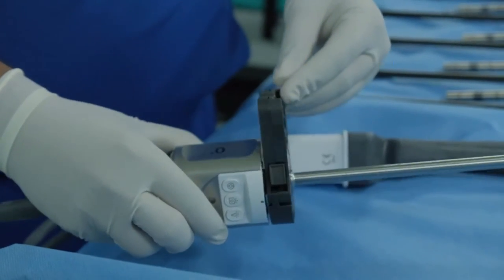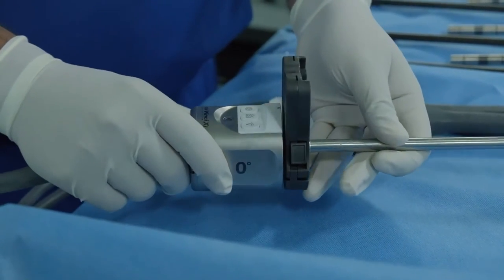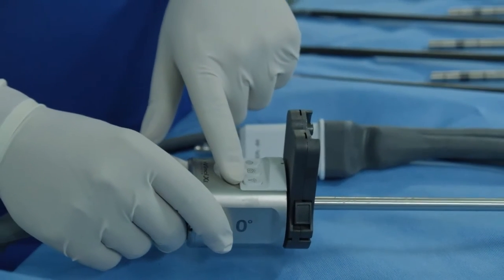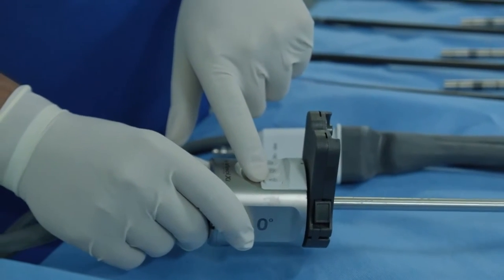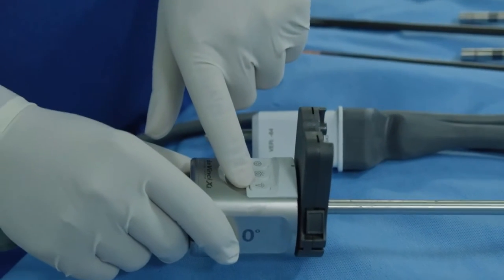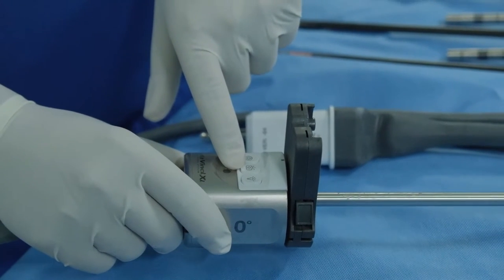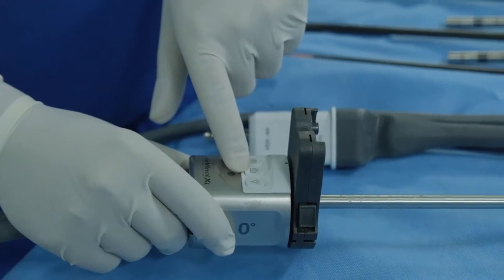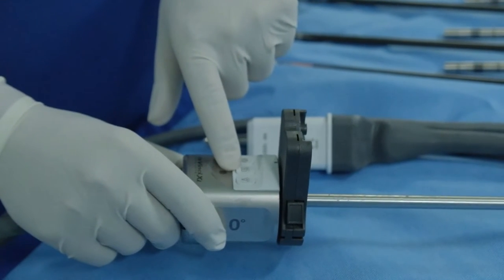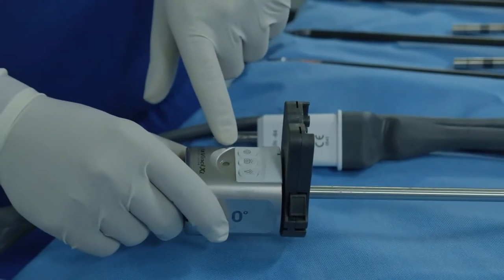It has a plate to get attached to the robotic system, the patient cart, and here are the buttons to control the illuminator. So if you press this button for a few seconds, the illuminator will get switched on. This is a button which can be pressed to take an intraoperative picture. If a USB drive is plugged into the vision cart, an intraoperative picture can be clicked either by using this button or by using the surgeon console controls.